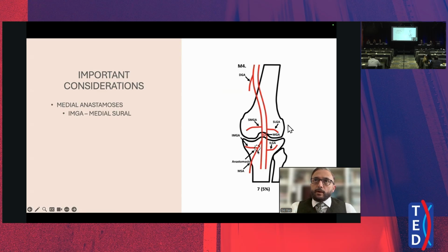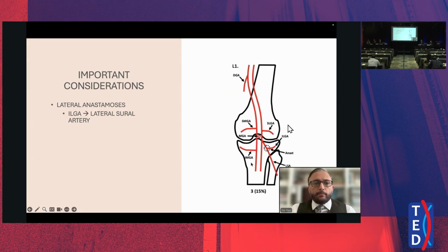Sometimes, and this happened a couple of times during my early cases, I would inject permanent particles and they would actually form painful calf nodules. Obviously that was more than 1,000 cases ago, but I've learned my lesson. So you have to be very careful about this sural artery.